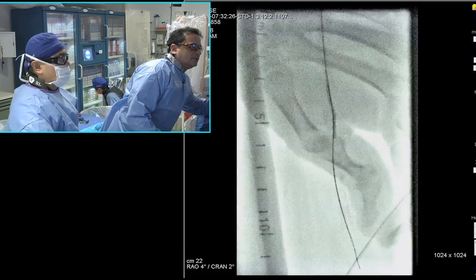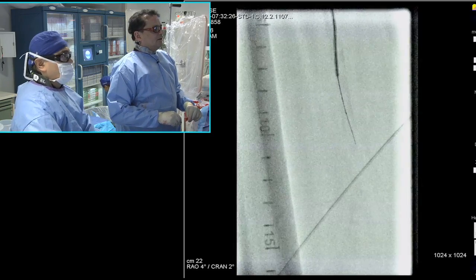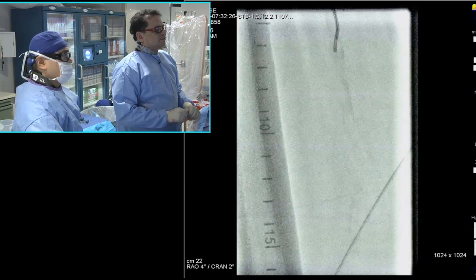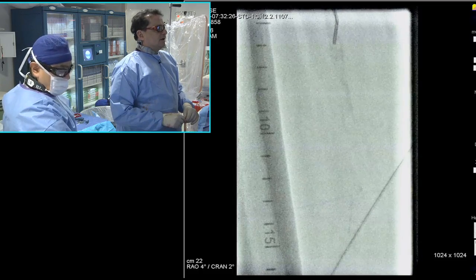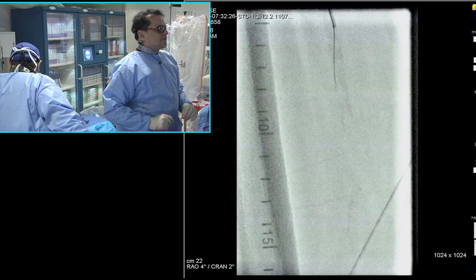It clearly looked like you definitely had some thrombotic debris, and you can see how this catheter just flows freely through that. And let's see here. There, it's not. I'm going to try to torque it on this end here, try to direct it to another spot. The other thing you could do, and I've seen this done, is very simply just go with a fine cross and just push it down and see how far it goes.